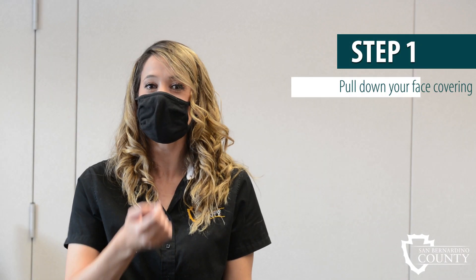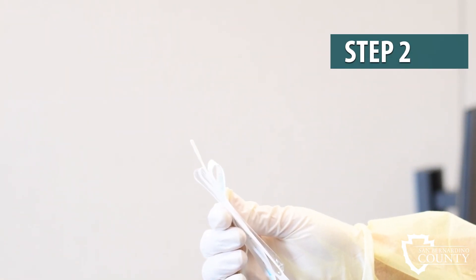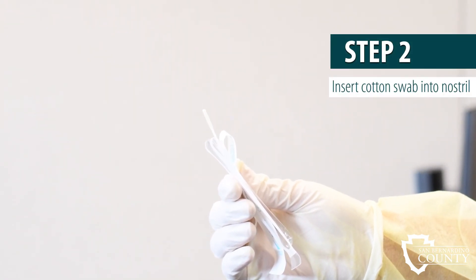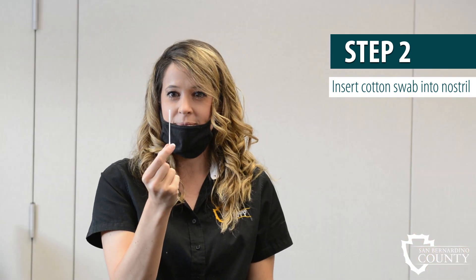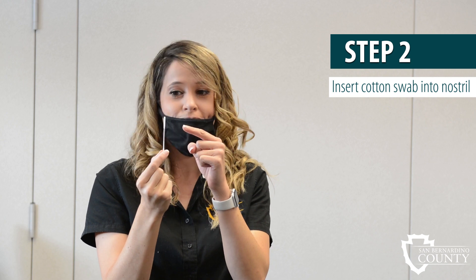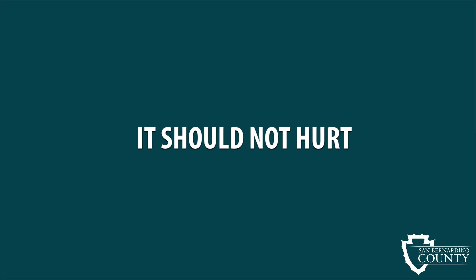Step 1: Pull down your face covering to expose your nose. Step 2: Medical staff will hand you a swab. Be sure to only touch the plastic side — do not touch the cotton end. Insert the cotton side of the swab into your nose until you feel resistance. It should not hurt.